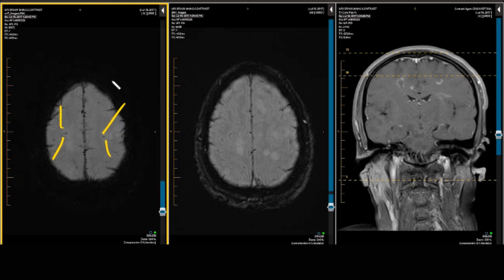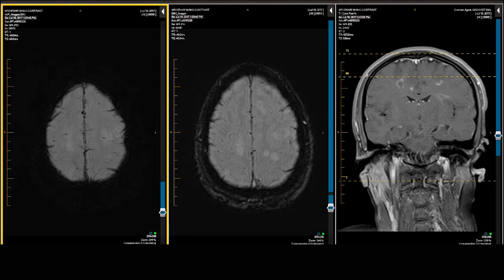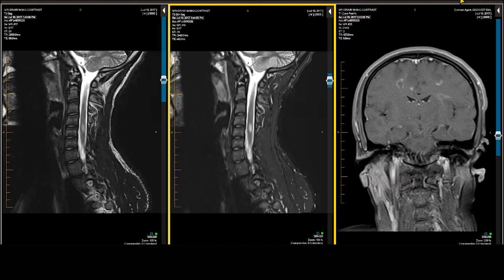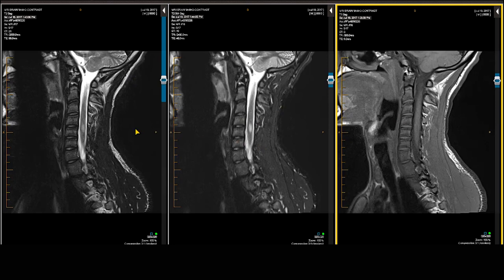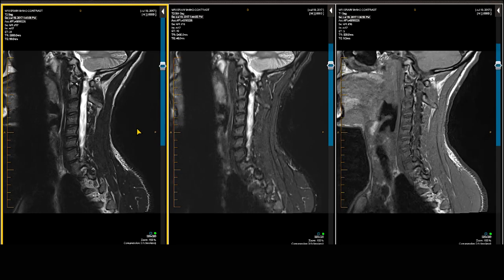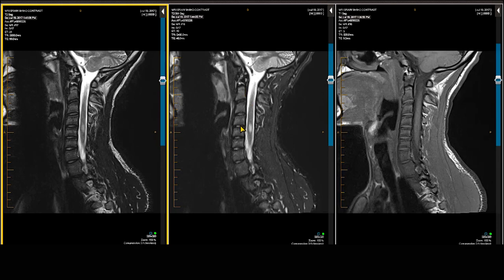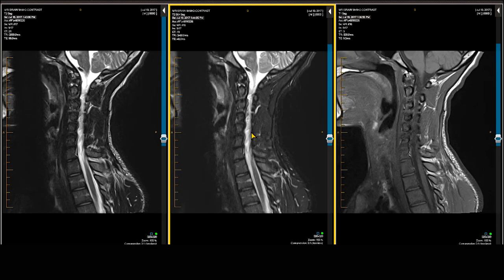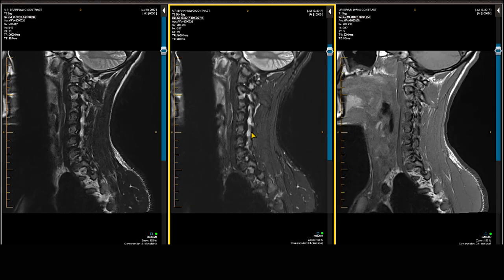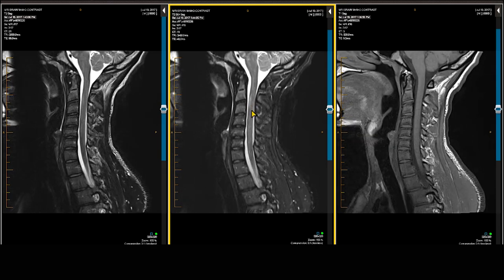Finally, we look at the cervical spine that was also included. The typical MS protocol includes sagittal and axial scans through the cervicothoracic spine — we do not need to do the lumbar spine since the spinal cord generally ends at around L1. Scrolling through the T2-weighted, T1-weighted, and STIR scans, we see an area of bright signal intensity within the spinal cord at the C4-5 level on the sagittal scan. There is also another area of peripheral cord high signal intensity at the C2-3 level.